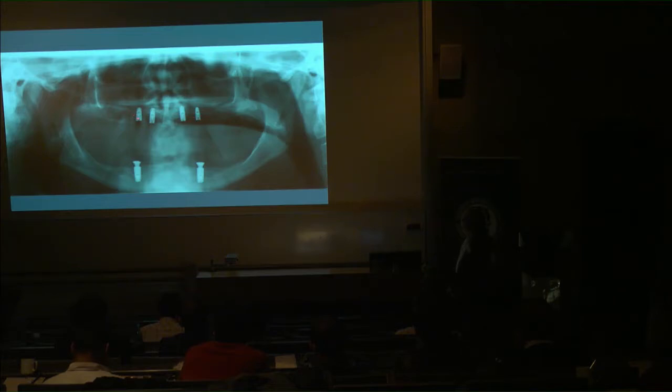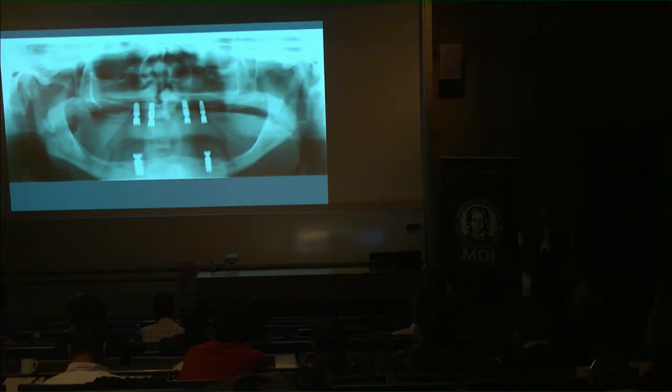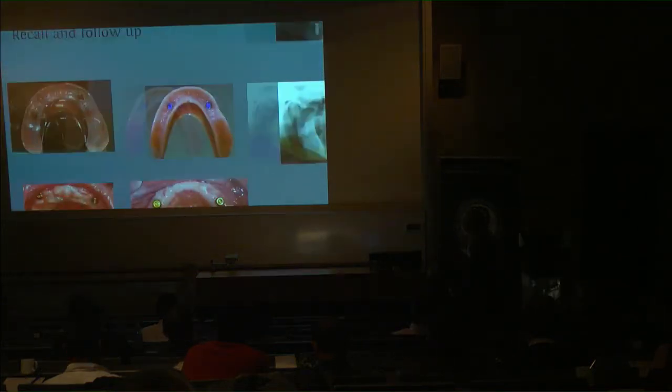So the concept was 4 implants in the upper, placing the 2 posterior as close to the sinus as we could get without doing sinus lifting, 2 anterior implants, and 2 implants in the lower, preferably in the first premolar site and the canine site. Re-entry approximately 3 months later, fitting an attachment, in most cases locators, in a few cases ball attachments, the older ones. And I had also done some Go Direct implants, which are one-piece implants with a locator on one end. I won't recommend that, but that's another story.